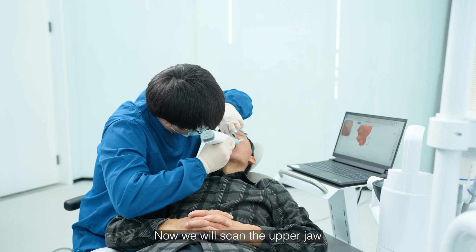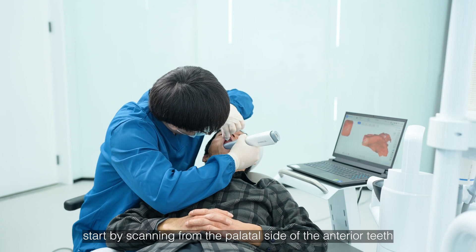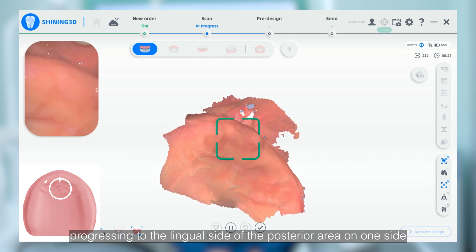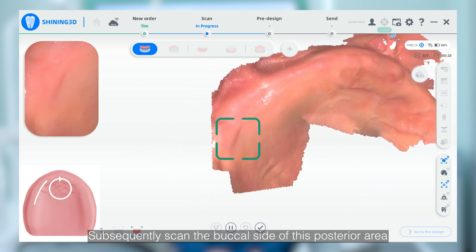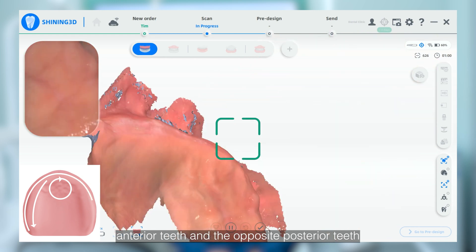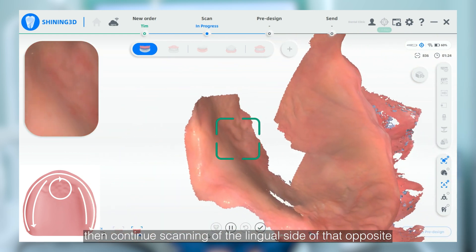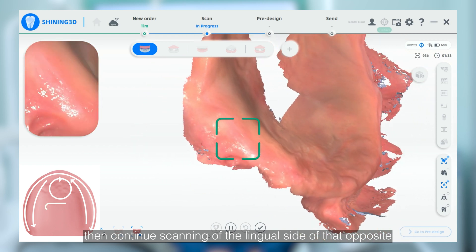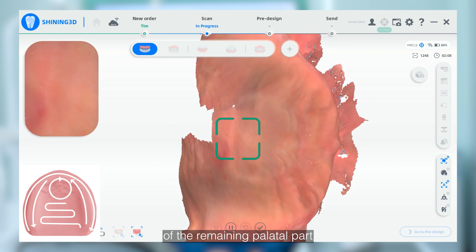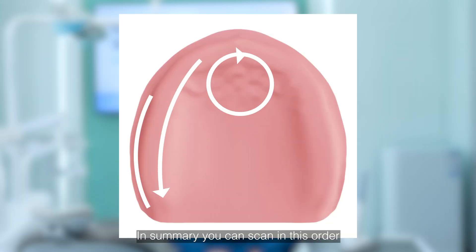Now we will scan the upper jaw. Start by scanning from the palatal side of the anterior teeth, progressing to the lingual side of the posterior area on one side. Subsequently, scan the buccal side of the posterior area, anterior teeth, and the opposite posterior teeth. Then continue scanning the lingual side of that opposite posterior area, concluding with a final scan of the remaining palatal part following a zigzag trajectory. In summary, you can scan in this order.